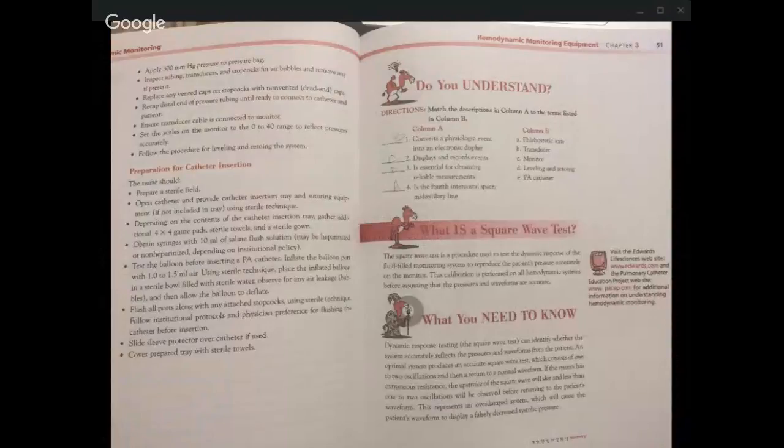Dynamic response testing, the square wave test, can identify whether the system accurately reflects the pressures and waveforms from the patient. An optimal system produces an accurate square wave test, which consists of 1 to 2 oscillations and then a return to a normal waveform.